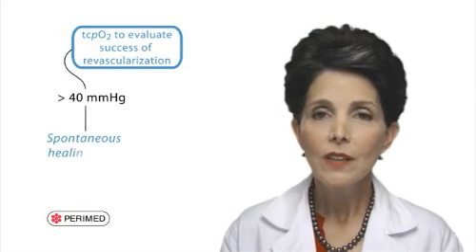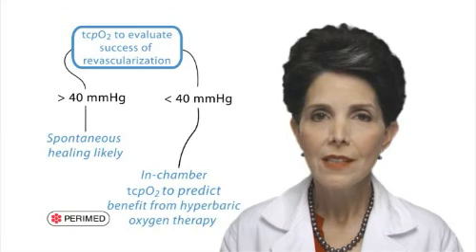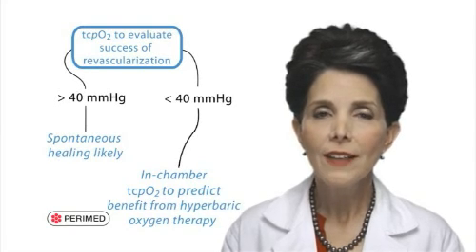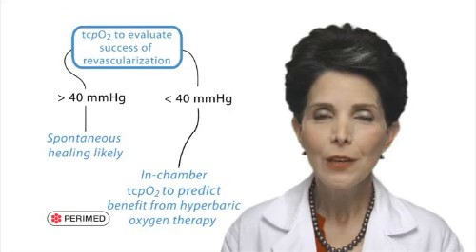After revascularization, you might repeat the TCPO2 study. If the normobaric air values are still low, then you might consider an in-chamber test to determine whether hyperbaric oxygen therapy would be helpful, assuming the patient meets the criteria for this treatment. It will not be possible to perform one transcutaneous study and obtain all possible answers to all questions.